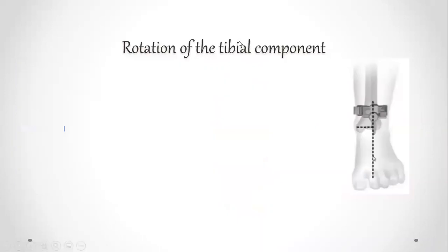So what about another reference? Angulation. Okay. There are other references regarding the tibial rotation, that of the bimalleolar distance. Some surgeons use an external tibial cutting jig. When you are using it, you can divide the intermalleolar distance into two, and the reference will be just at this point.